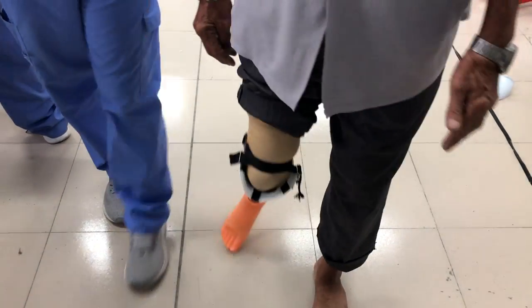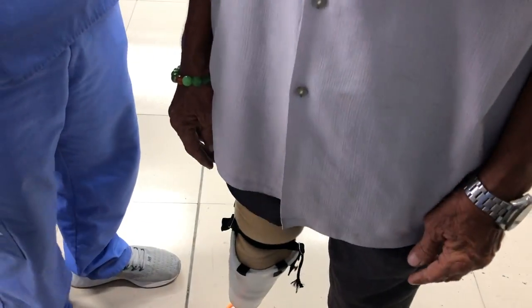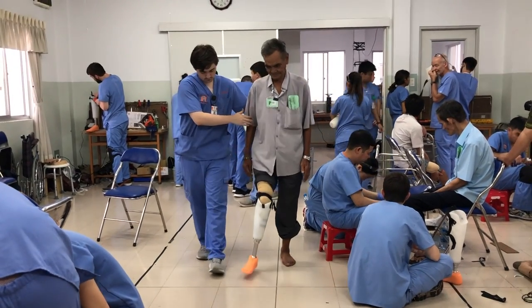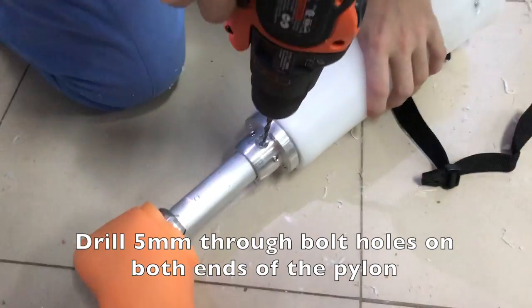Once you and the patient are happy with how the patient walks, get Dr. Vo's approval, make any adjustments he requires, and begin cosmetics.